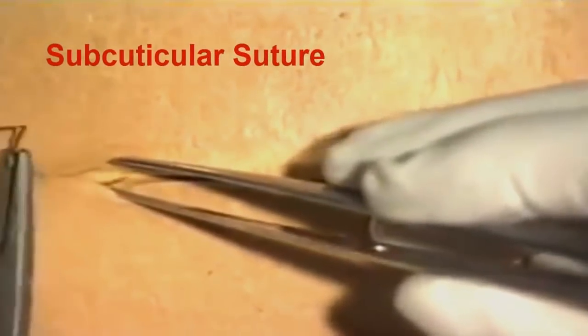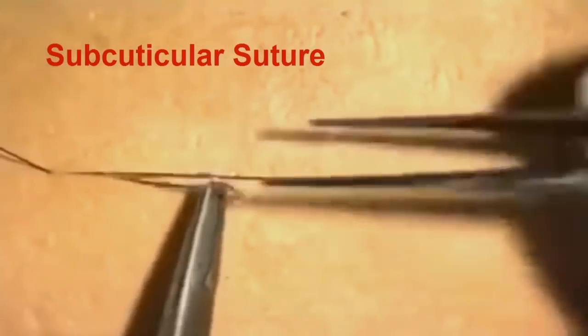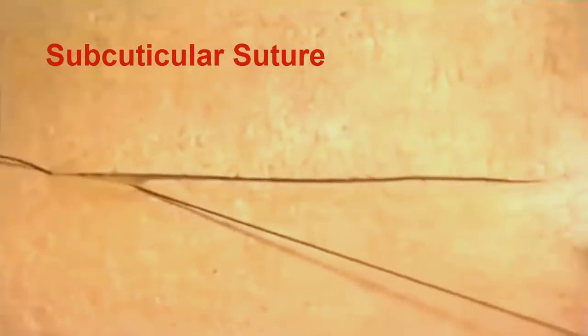Start the subcuticular suture by inserting a knot at the far end of the incision. Tie a standard reef knot and then cut the short end of the suture very short, as we are going to bury the knot. Then using the forceps, carefully retract the skin edge.